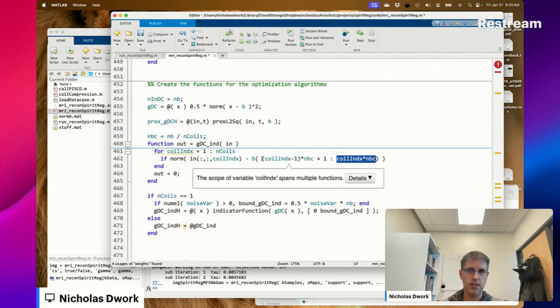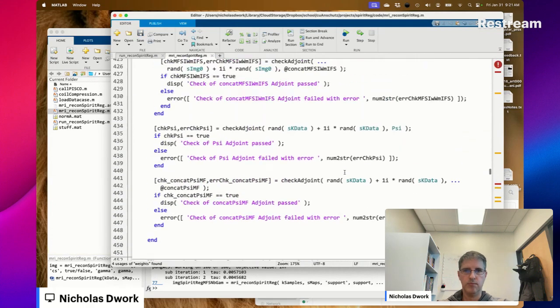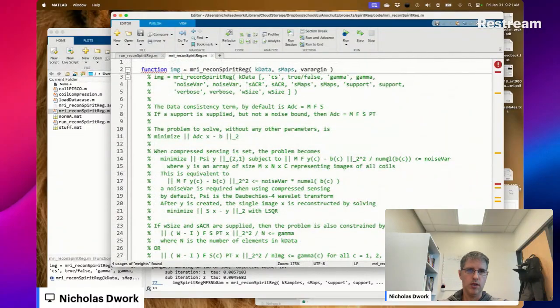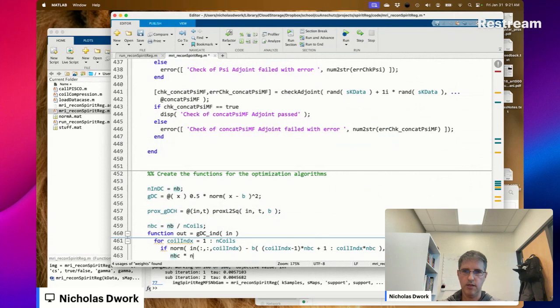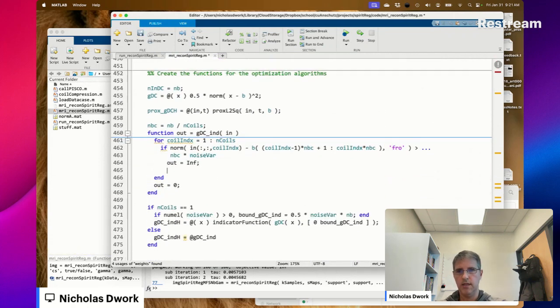For coil index 2, this is NBC plus 1 to 2 NBC, etc. And we're going to use the Frobenius norm there. Huh. Is greater than NBC times noise var, then out equals infinity and return.